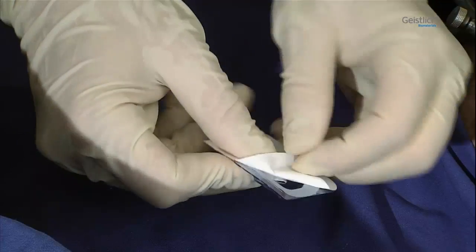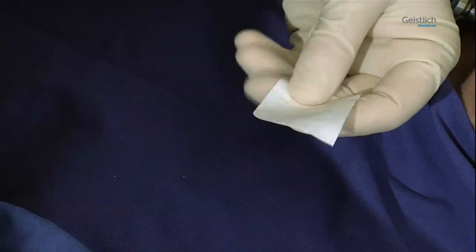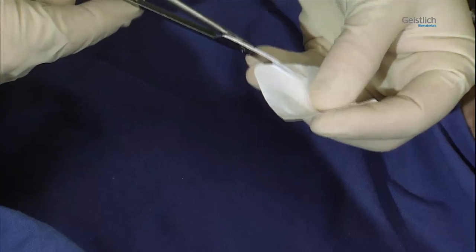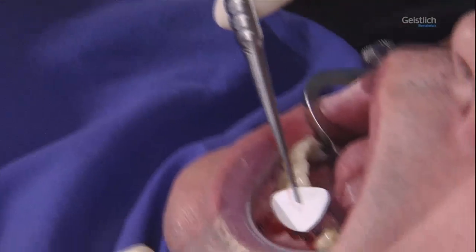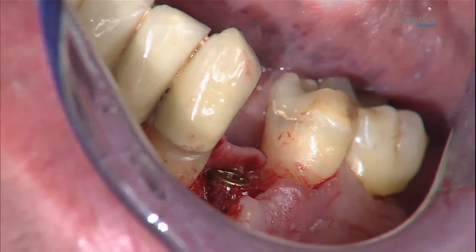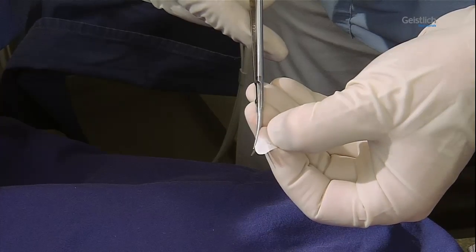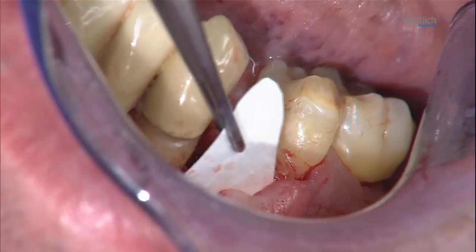Once we have removed the membrane from its packaging, the paper of the blister pack can be used as a template to determine the proper size and shape for the membrane before working on the actual membrane. We cut the template to size and hold it against the defect to check its dimensions. In this case, the template is further adapted to attain a pear-shaped form, ensuring that the membrane will completely cover the implant and the bone defect.